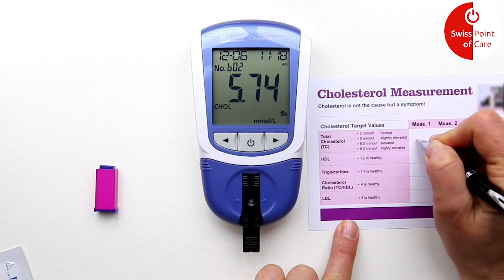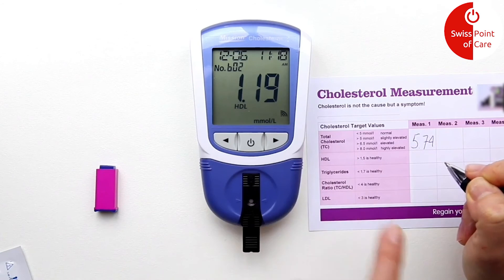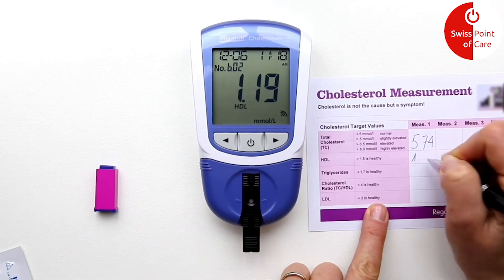With the three in one strip, the meter first shows the total cholesterol content. You can then go to the HDL level, then the triglyceride, then the cholesterol ratio, and finally the LDL.